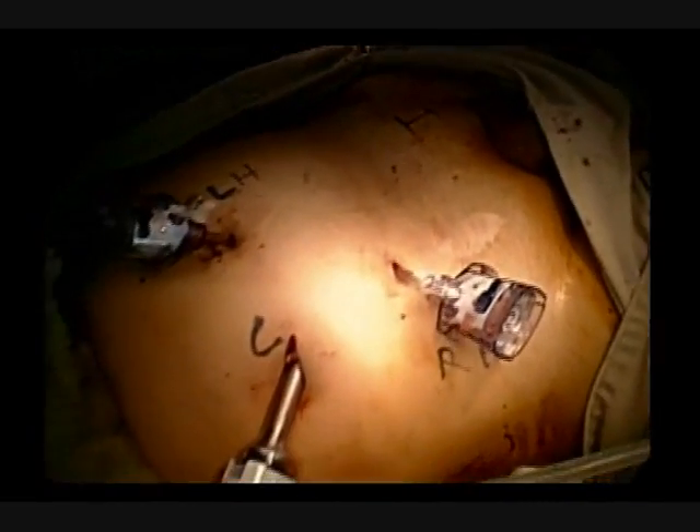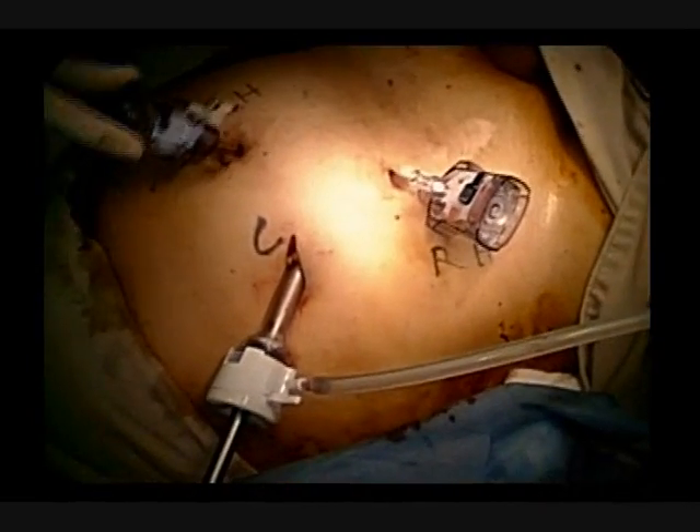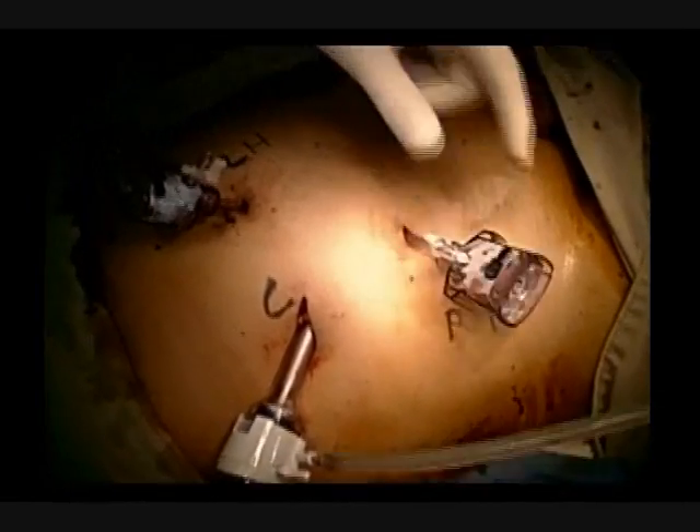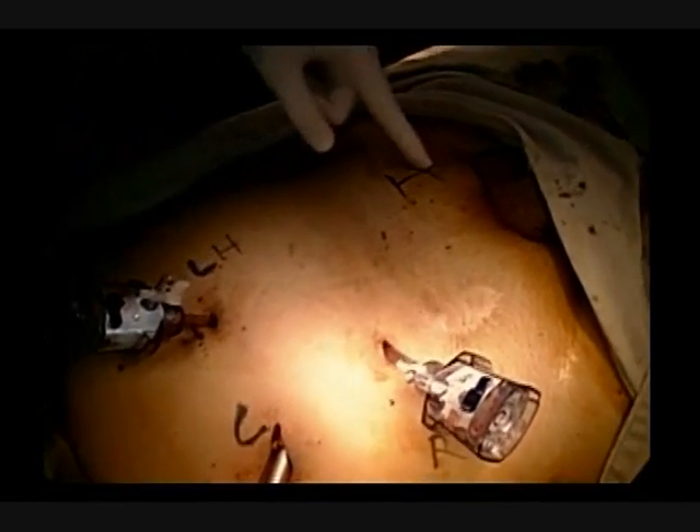Patient has an incarcerated left inguinal hernia. The surgeon's left hand trocar is at the level of the umbilicus, the right hand trocar high in the right inferior quadrant, and the camera trocar in the right flank.